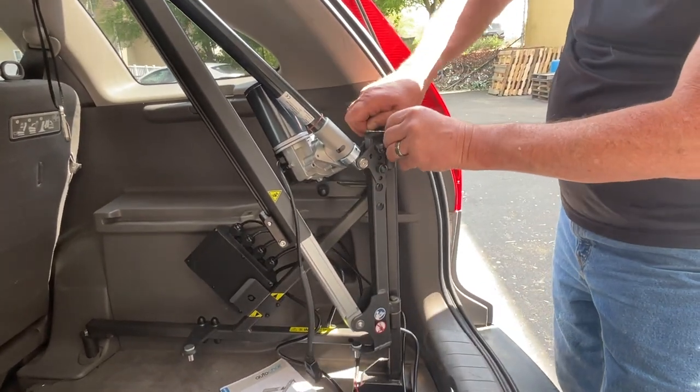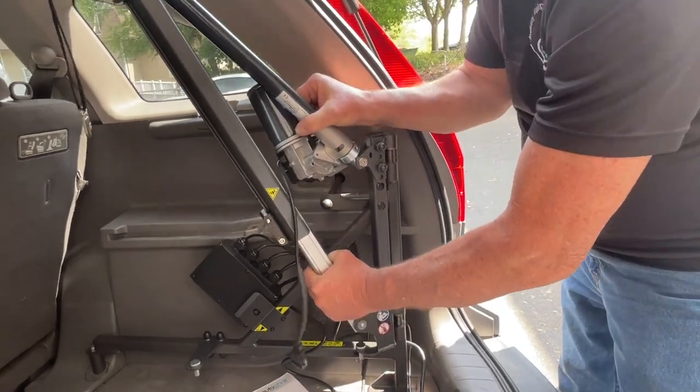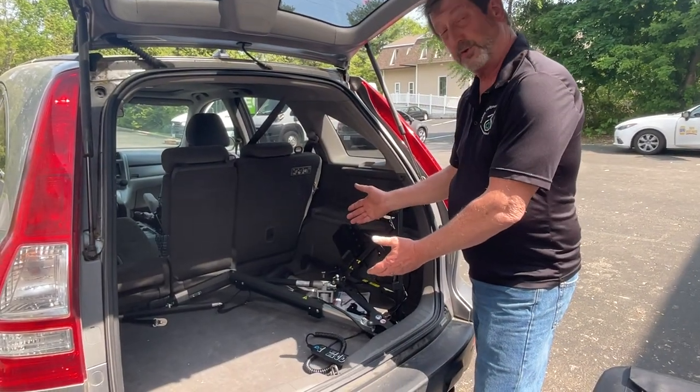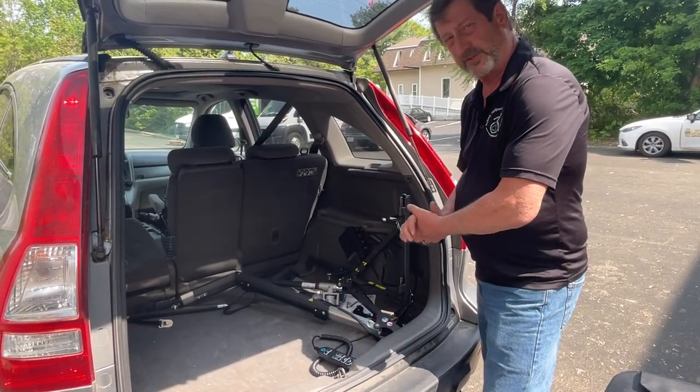Hold the top pin there, and this can be lifted back and laid down. This frees up additional storage space even while the lift is installed.